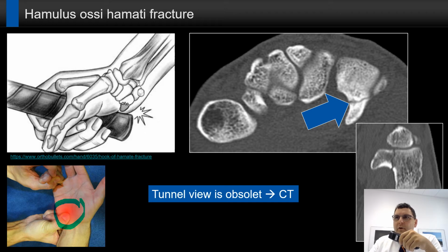It's not so uncommon that these fractures are also diagnosed as a side finding in MRI for people who do not recover after trauma. So I have seen a lot of first-line diagnoses on MRI in these cases because nobody thinks about the fracture of the hamulus.